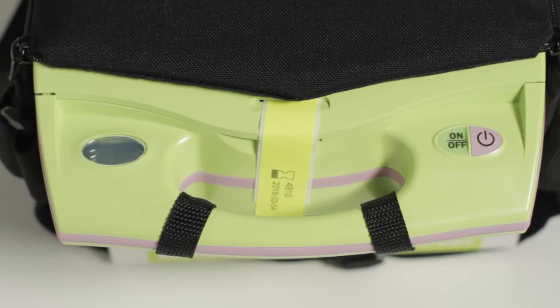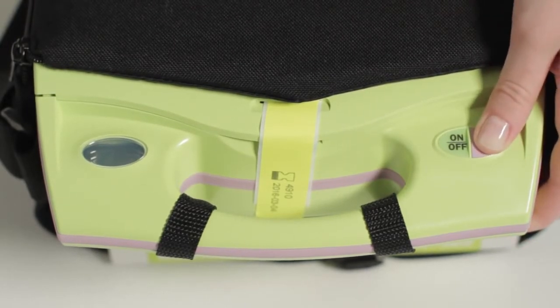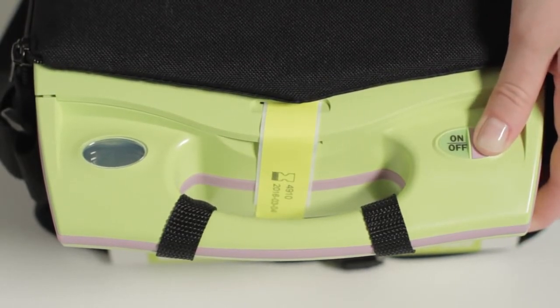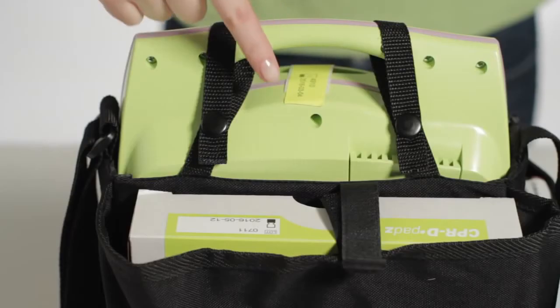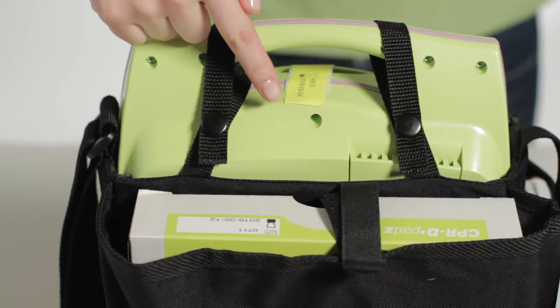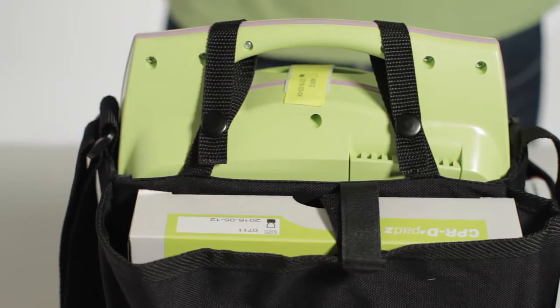Notice that once in its carrying case, you can completely test and inspect your AED Plus without having to remove it from the carrying case. You can hold down the on-off button to initiate a self-test, and then see the results on the display window. You can see the expiration date on the tab for the pad currently plugged into the AED, as well as the expiration date on the label of the backup pad.